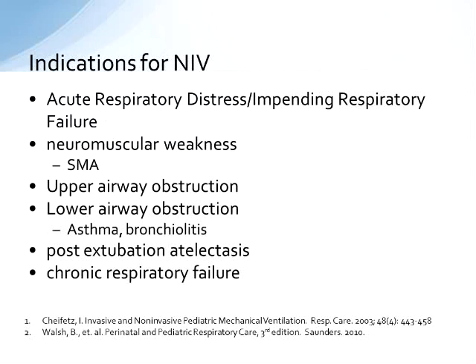Lower airway obstruction, so there's lots of discussion about using non-invasive ventilation for our patients suffering from status asthmaticus. As I mentioned, this is becoming a more popular modality for our little guys that come in in severe respiratory distress associated with bronchiolitis. It can help to prevent or treat post-extubation atelectasis by imposing some PEEP, and is used for patients with chronic respiratory failure as well.